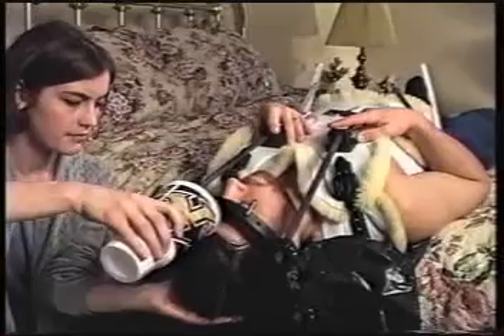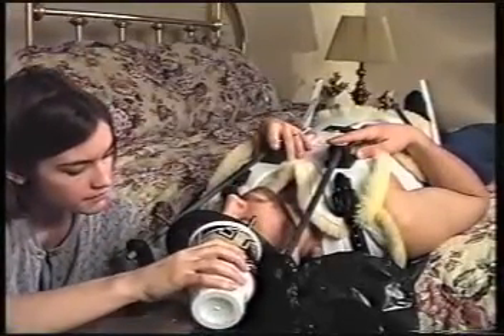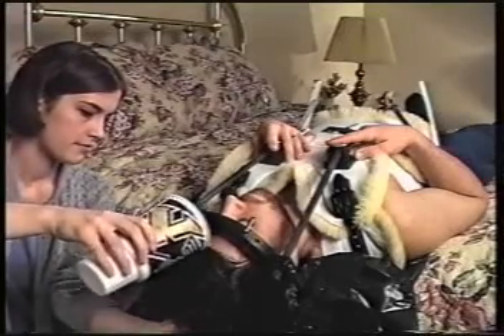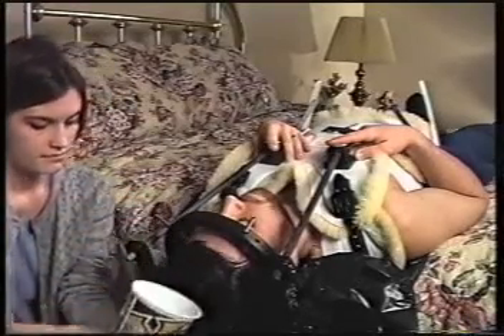Use a gentle shampoo only. Do not use hair coloring, permanent curl solutions, or other hair treatments because the chemicals could infect or irritate your pin sites. After your hair is washed, the pin sites need to be cleaned.